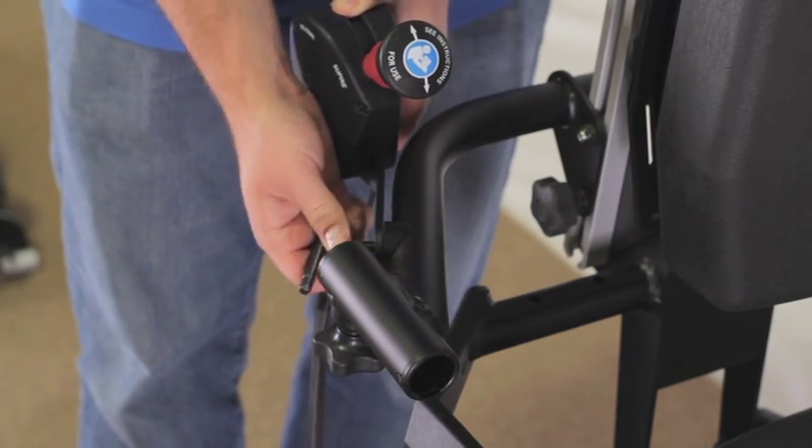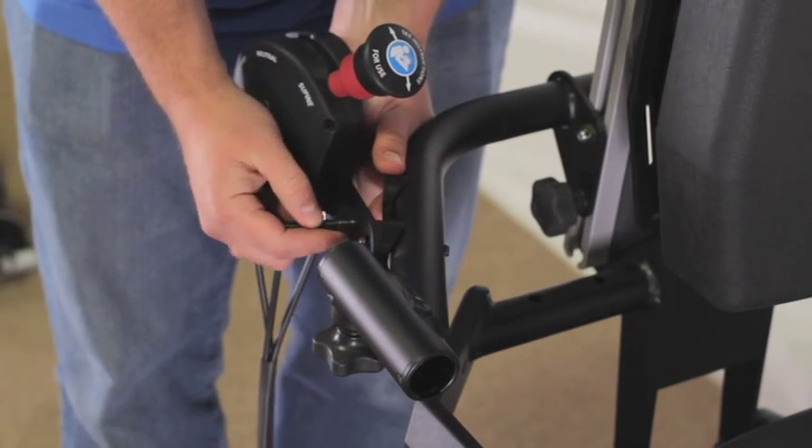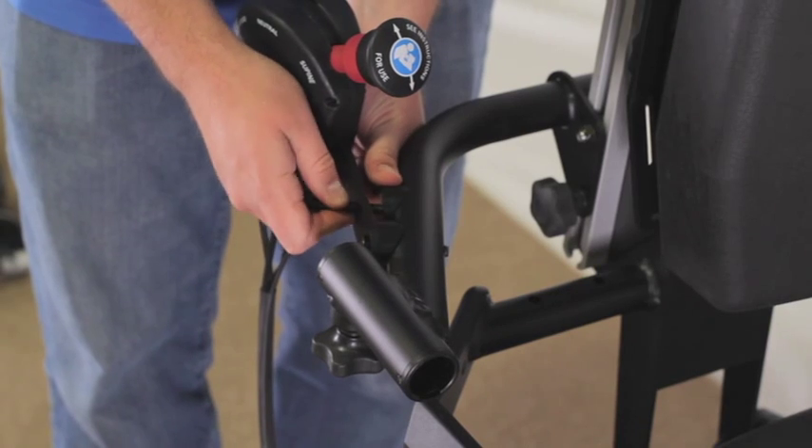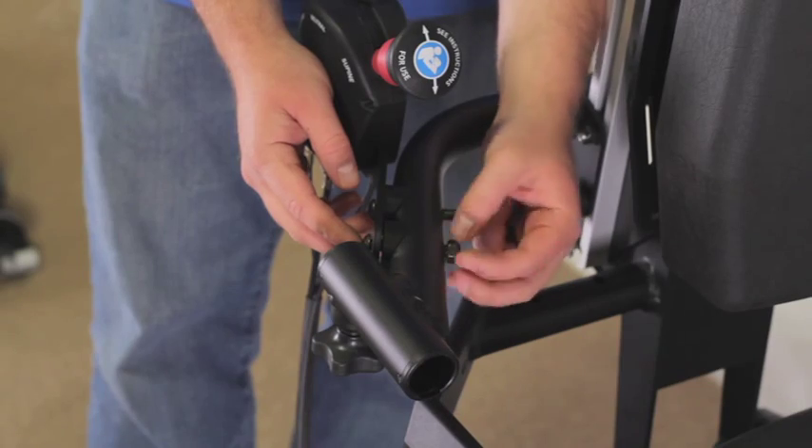One at a time, place the bolts and coved washers onto the supine controller bracket as shown. Place nuts onto the bolts using an allen wrench and the wrench from the tool kit. Tighten securely.